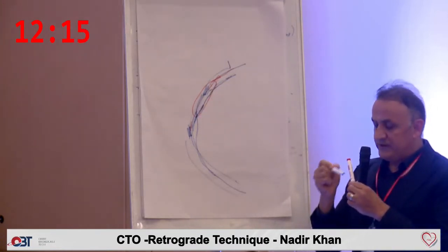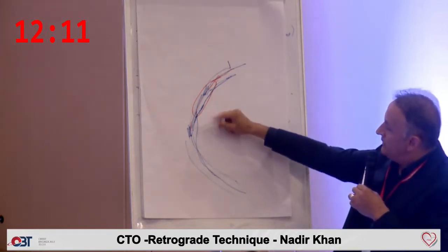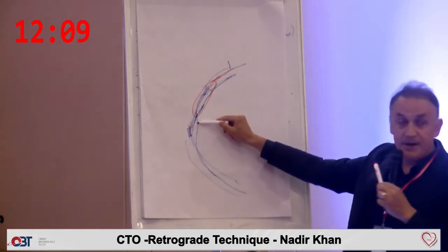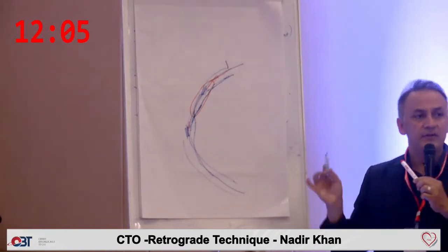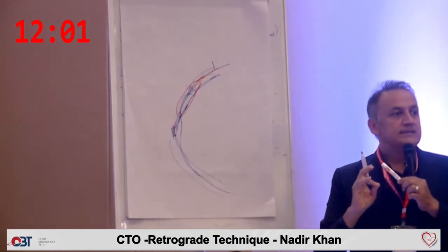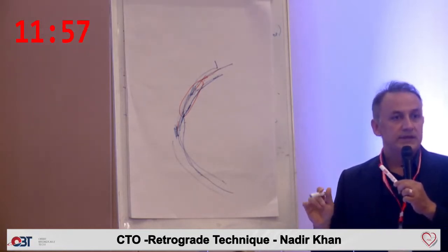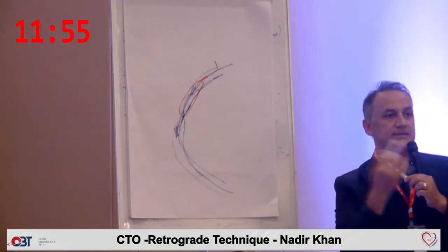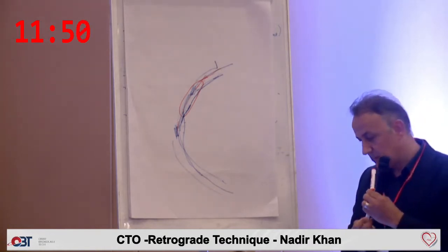The most difficult scenario is our wire retrogradely subintima, antegradely intima. This is the most difficult scenario. Others are easier. The easiest one is both of them in subintimal space. It's easier because subintimal space easily connects to each other.